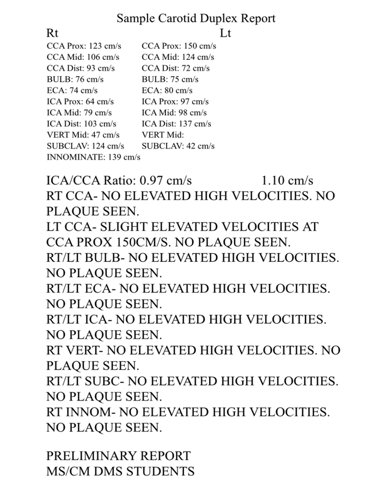And here's the report that was completed after the exam. You can see that there's the right and left velocities for each vessel that Myra evaluated. These velocities were recorded in the calcs, as you saw her calculating and putting them in.